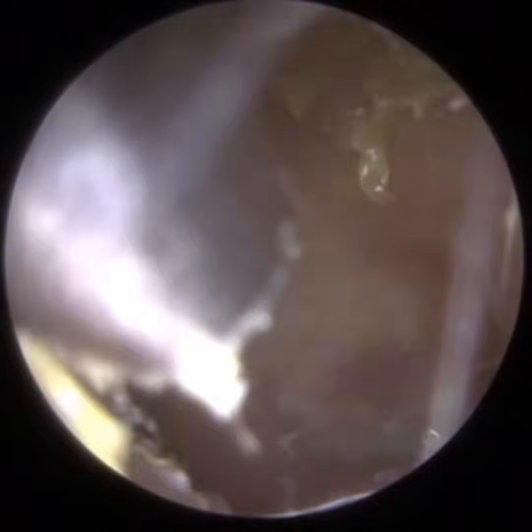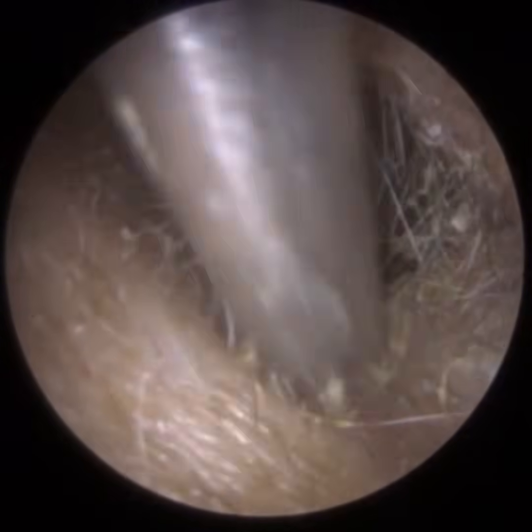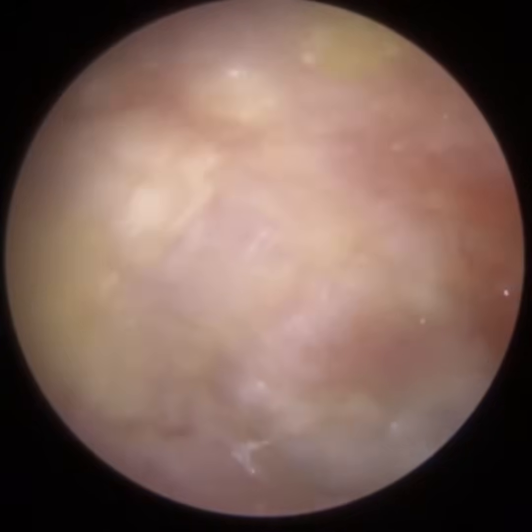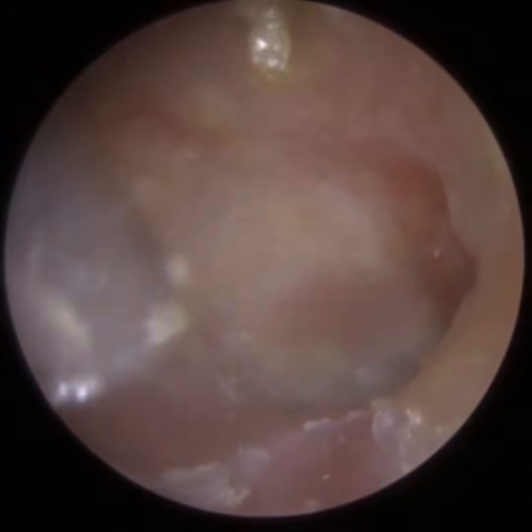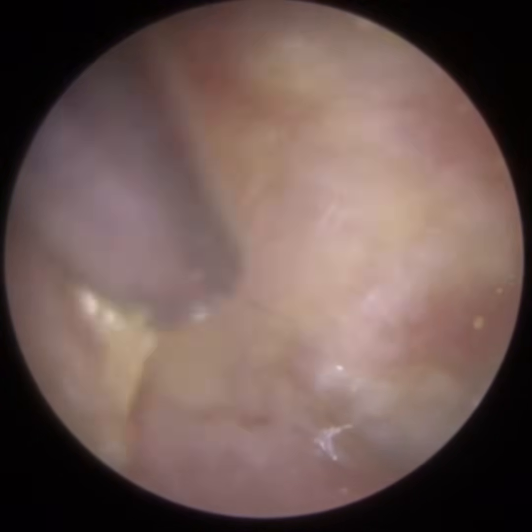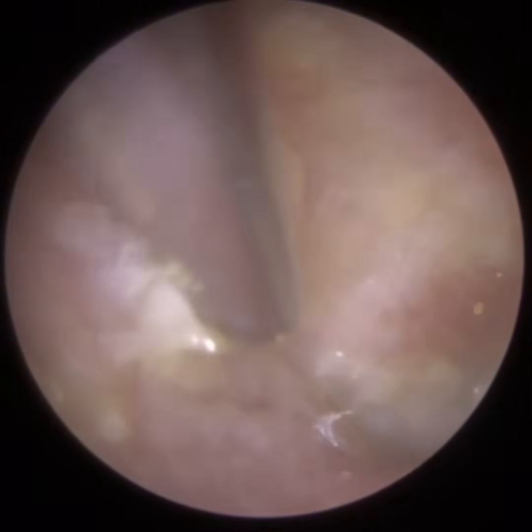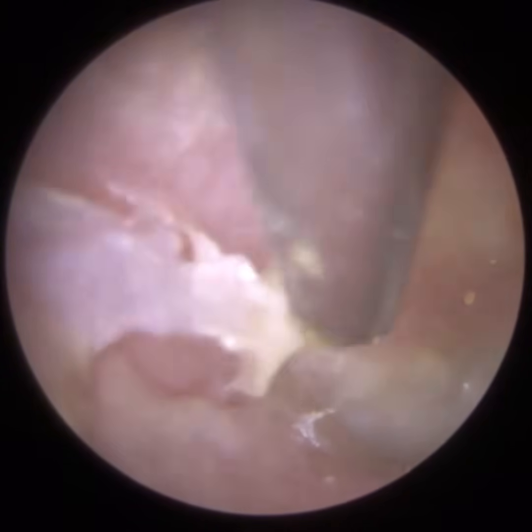So again, just going to mop up near the entrance, just some more keratin there, dead skin. It's a bit stickier. On several occasions, my fine end got blocked, so I had to unblock it. I think I used 2 or 3 fine ends in total, because on a couple of occasions it got so blocked that I had to discard it and get another one. So again, this damp layer of dead skin, it's like an onion. I'm going to peel it away.